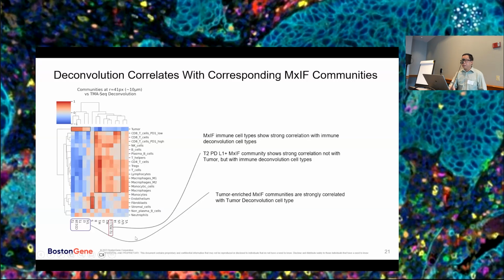It's interesting to see this T2, which means tumor tissue with proliferating capability, the Ki67. If it's PD-L1 positive, you can actually see this community clustered together with the immune phenotypes, but less with the tumor. So this is a very interesting part.